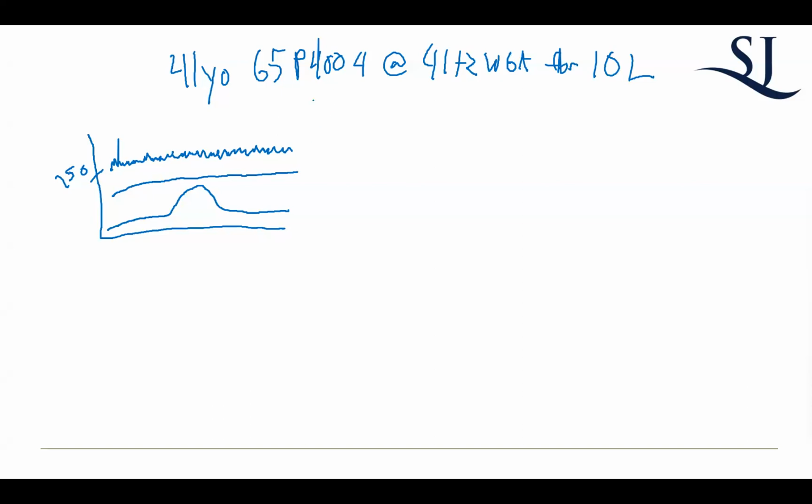Well, we'll start kind of from the top. So first thing is baseline, right? How's the baseline? The baseline is fine. For the fetus, the heart rate is normal. It's within 110 to 160. So it's probably about 150, right? So your baseline is 150 beats per minute, let's say.